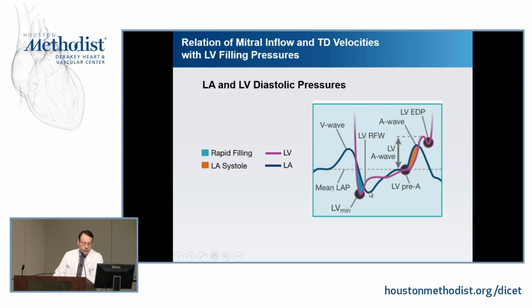And then the atrial pressure continues to rise again. Why? Because there is flow of blood from the veins into the atrium. You get another positive pressure in the atrium, an A wave. This time it is due to atrial contraction. And then the pressure drops again with an X descent. To get these nice clear signals, you usually need a catheter in the LA. However, some pulmonary venous wedge pressure recordings can also be decent and show you these. What pressures can we measure aside from the V and the A waves?